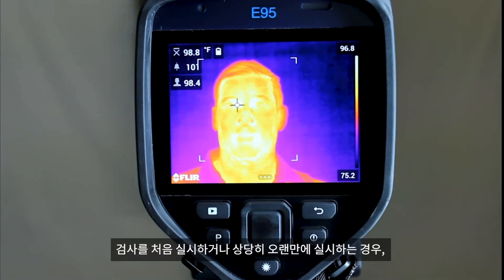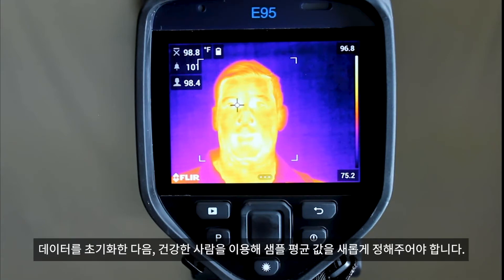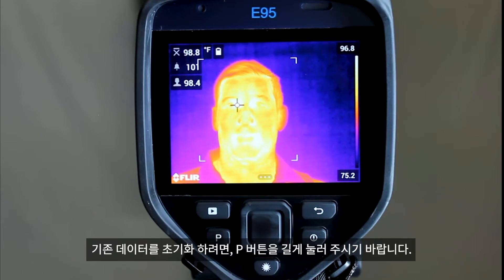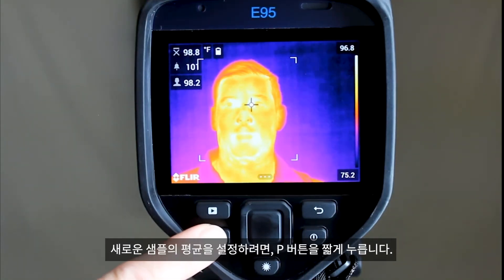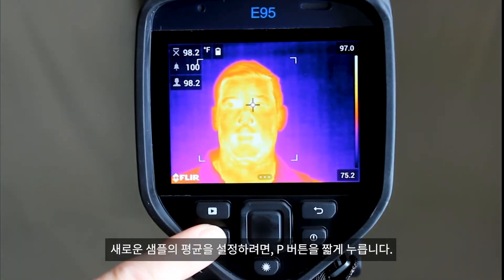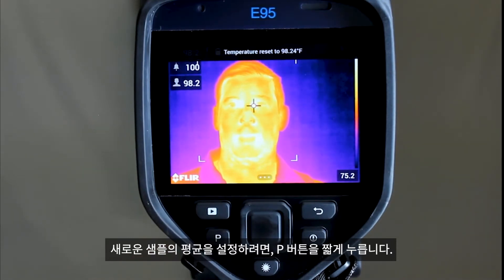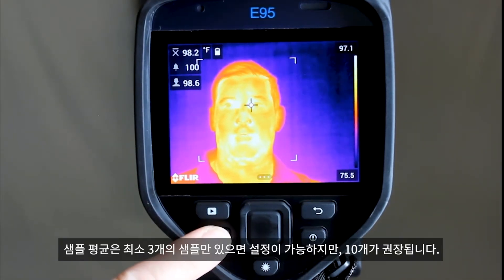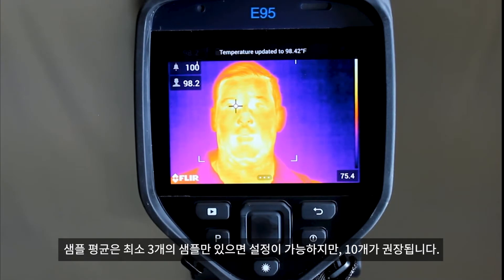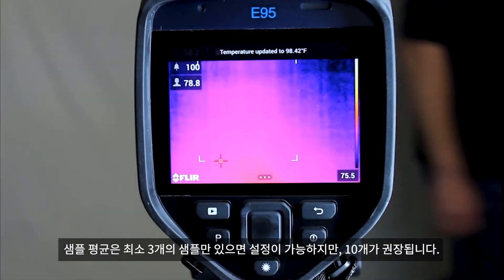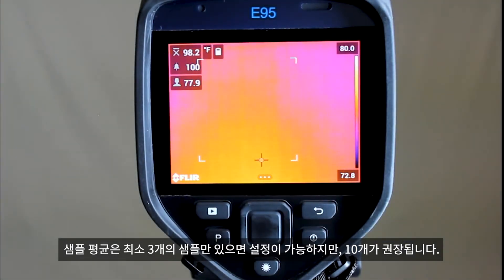If this is your first screening of the day, or if it has been some time since your last screening, you will need to reset the old data and begin building a new average from healthy temperature samples. To reset the existing data, press and hold the P button. To average in additional samples, short press the P button. You will need at least 3 samples, with 10 being advised, for a more accurate average.